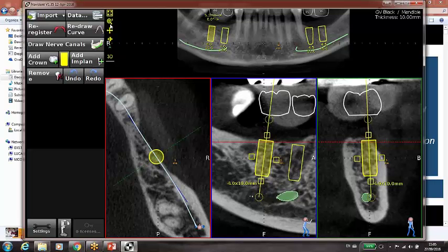In other words, the requisites of the scanning are chosen according to the requirements. 0.40 max, we said. Then a FOV, which is a minimum of 4x4. We said that either a cone beam or a CT can be used. The patient should not move, and should be scanned with the two jaws open. They do not need to bite. The two jaws need to stay open.